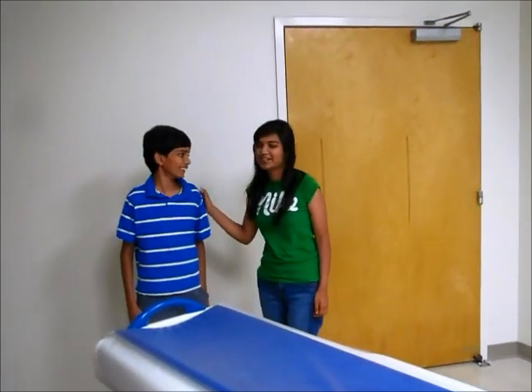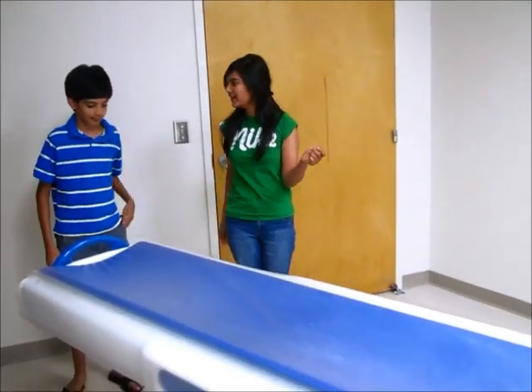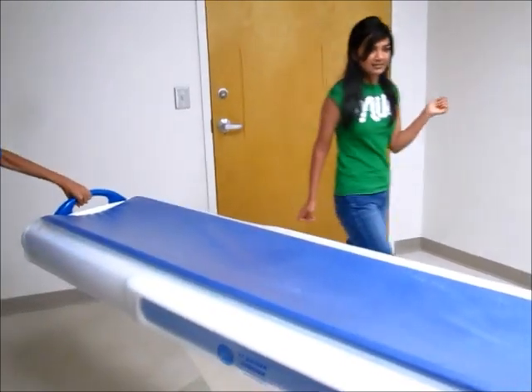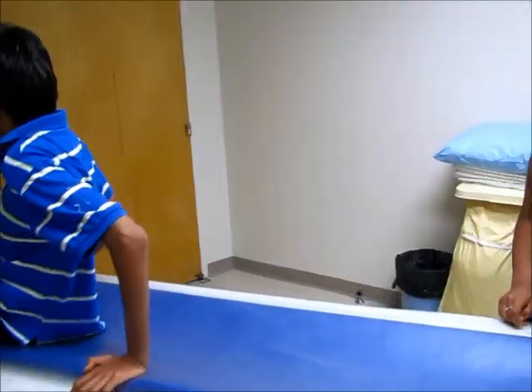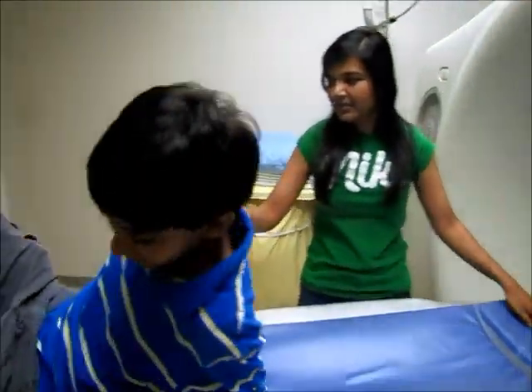Let me demonstrate. Here we have Mitt today. Hey Mitt, how are you doing? Good. Will you lay down for me? Yes. And your head goes here while the rest of your body is here.